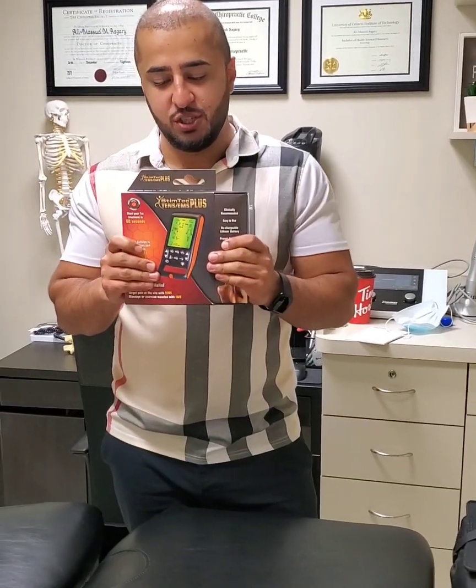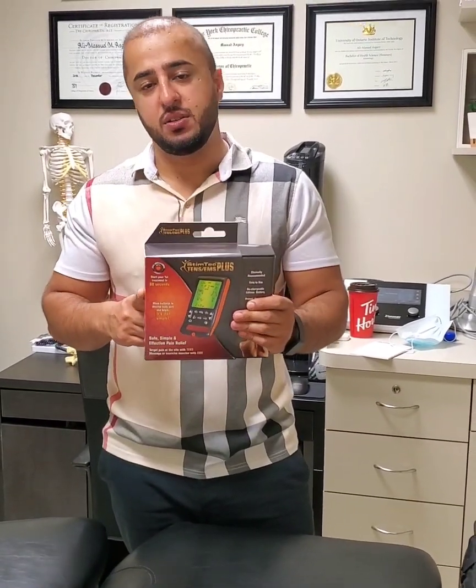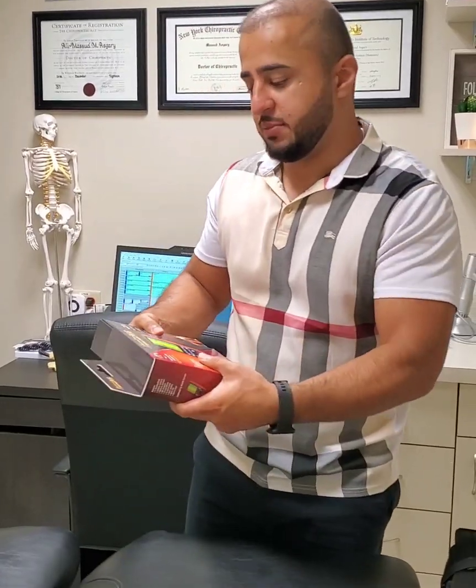Alright guys, congratulations on getting the TENS machine. I'm just going to be showing you how to use it. This is just an introduction to the TENS machine.